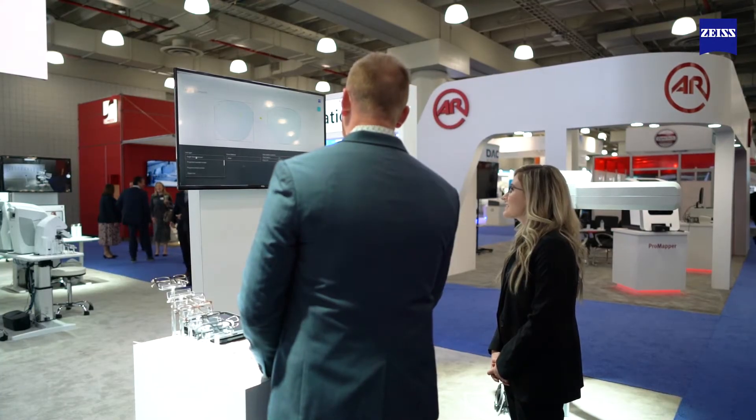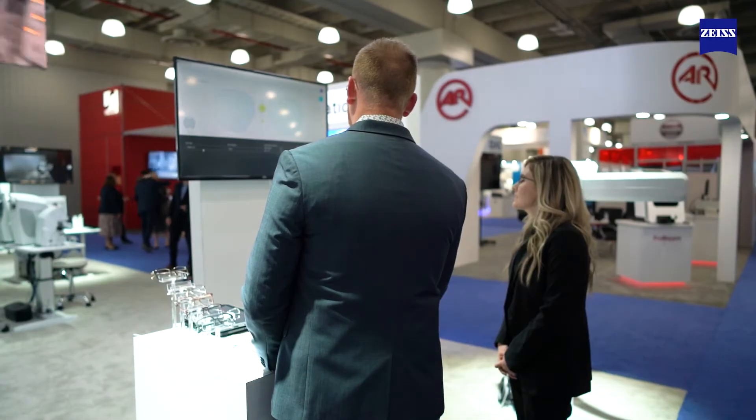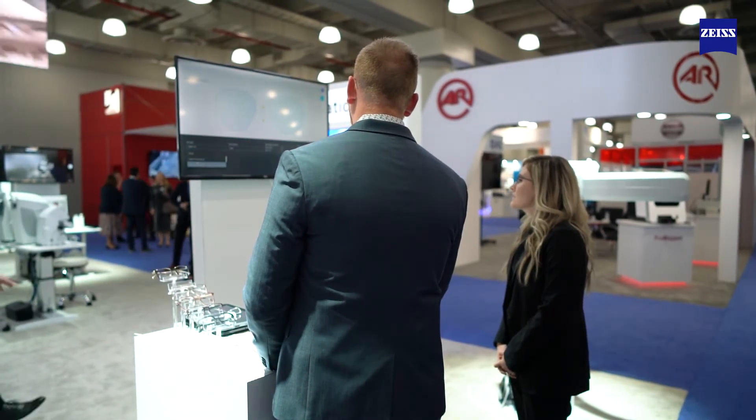We can choose our lens layout — so if we were fitting a progressive, a digital lens, or a single vision lens, we have all of them available.